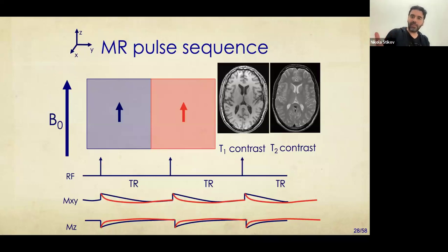So this mechanism, it's difficult to explain right away, and I don't expect you to have it intuitively right now, but you see how we can choose where we image and choose whether we're working more with the longitudinal magnetization or with the transverse magnetization to create different kinds of contrast. And this is very rare for medical imaging, that you can actually make any part of the body be either bright or dark, depending on what you're interested in looking at. Any questions about that, about the way that we generate contrast in an MRI?